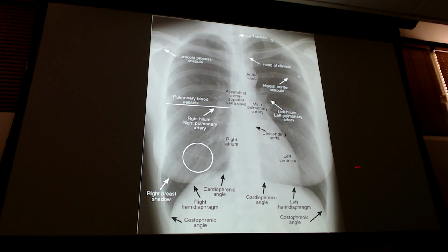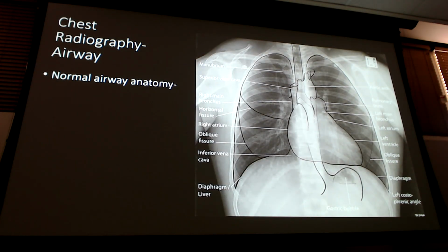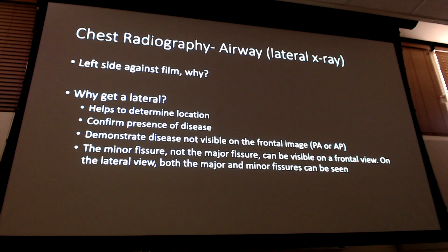This is not a mass. Well, it's not a lung mass. Those are breast shadows. Right? We have a female patient, that is to be expected. Do not let that throw you off. Sometimes people will look at that and say, oh, I saw this line kind of come up, so I thought it was a rib fracture. Trace your breast shadows just like you trace your bones. Okay? See a theme in lecture 1.